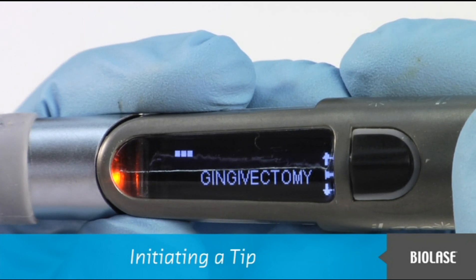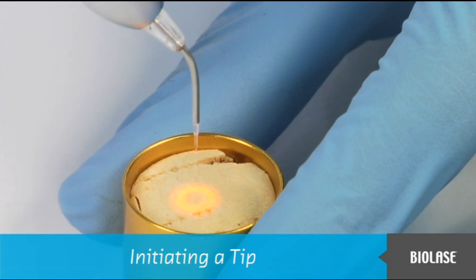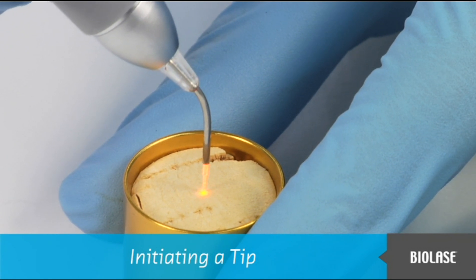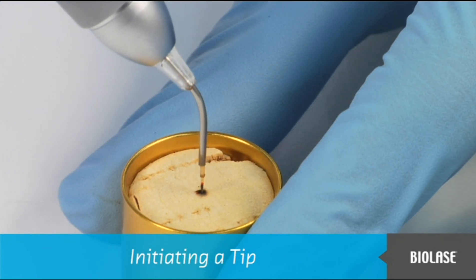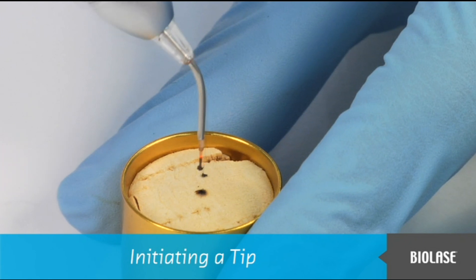After selecting a procedure, the iLaze will ask you to initiate a tip in order to properly cut tissue. Touch the iLaze tip to the surface of the initiation block without firing the laser. Now fire the laser, allowing the tip to sink into the block — count one, two, three. Pull the tip out of the block, count one, two, and stop firing. At this time, the tip should be out of the block. Fire the laser quickly into the air once — the tip should glow yellow-orange. During a procedure, there is a chance the tip might lose its initiation, so repeat the tip initiation procedure if necessary. After tip initiation is complete, press in the navigation button once to continue.